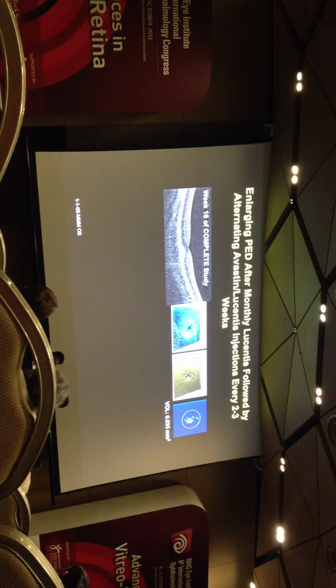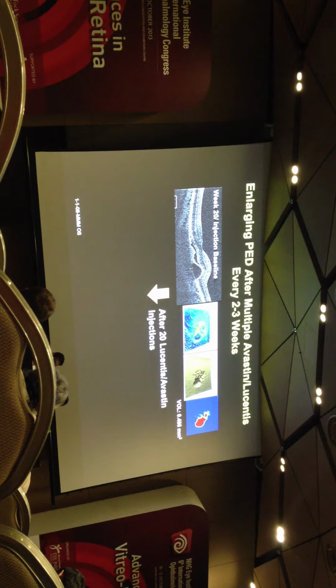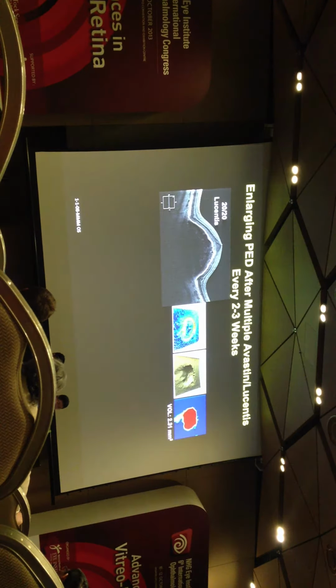This is a patient that was in our dry complete study, the same study as that other patient. This was the study eye, dry AMD, comes back 4 weeks later to turn to wet macular degeneration. No problem, we'll start treating. After 20 Lucentis and Avastin injections, given as frequently as every 2 to 3 weeks, not looking good. The PED volume is increasing. Vision, though, is pretty good, 20/20. Once again, you don't want to follow the vision in cases like that.